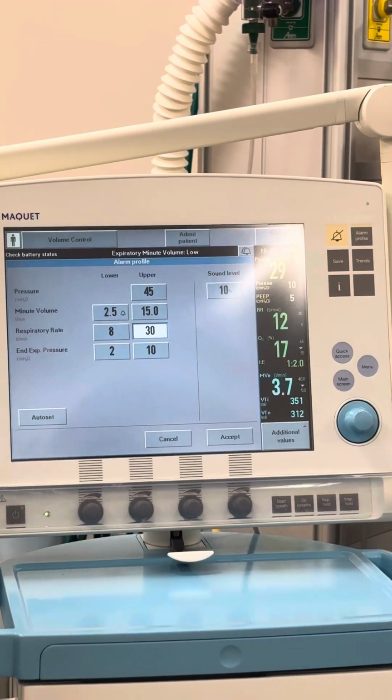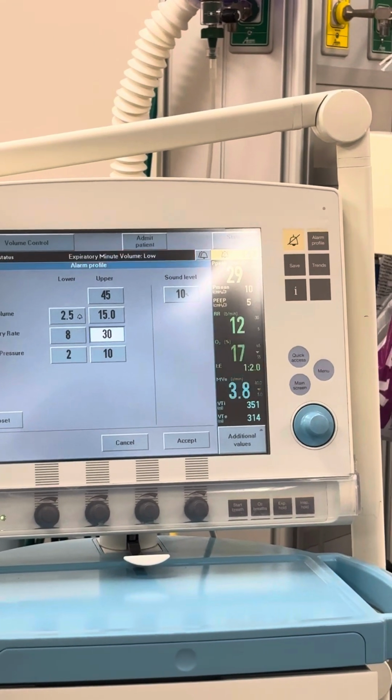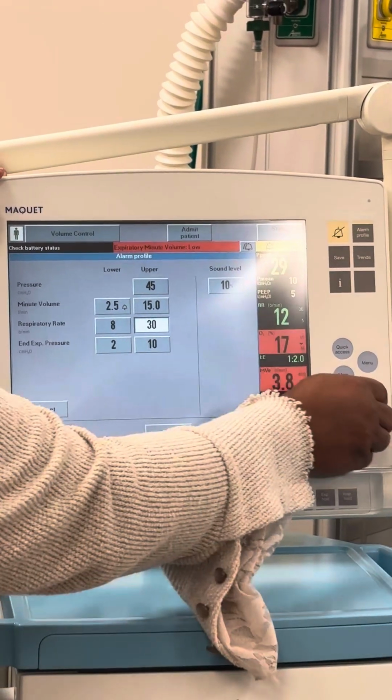What about above? 10 to 20, or around 22 or something like that? Y'all good with that? 25? I'm liking those kind of numbers today. How about y'all?